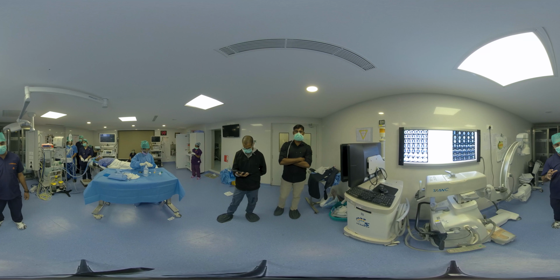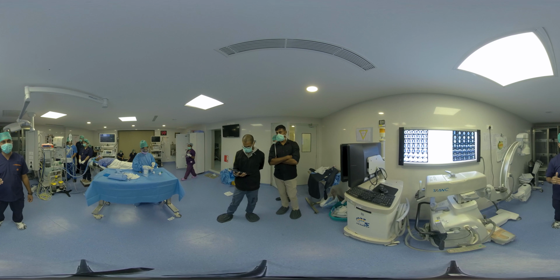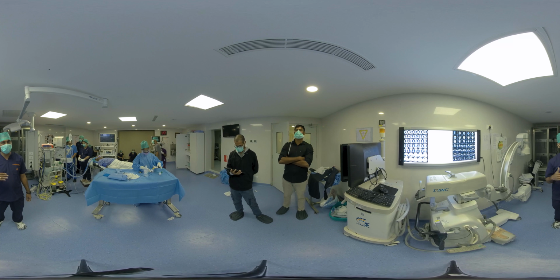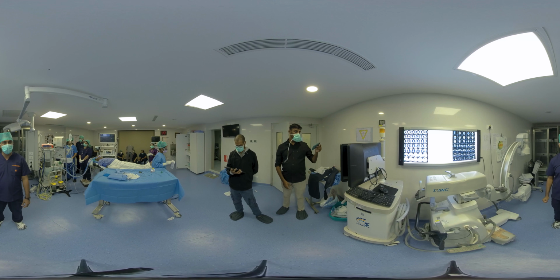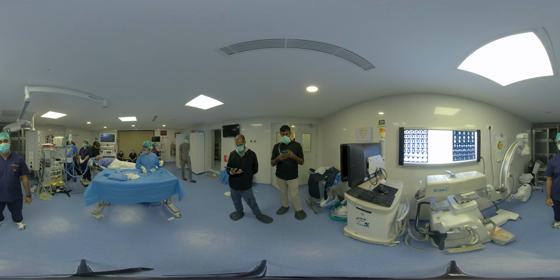This was a high risk case of rigid bronchoscopy and cryobiopsy where the patient was having CKD, he was having a triple vessel disease, and we had to stop the anticoagulation also for 5 days. So when we take such patients for procedures, we always explain to them the very high risk concern, and now you will be seeing that the procedure went very well without any intra-procedural complications, and most probably we will be extubating him here and we will be shifting him to the room.